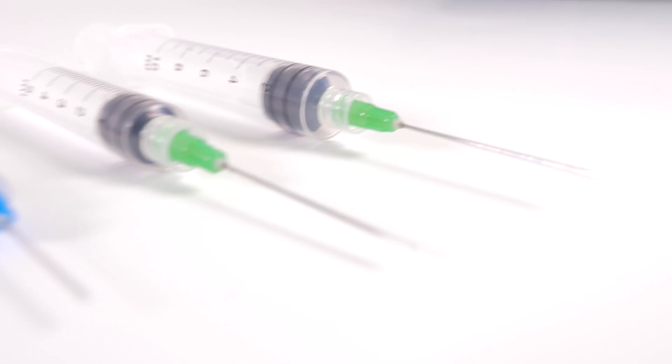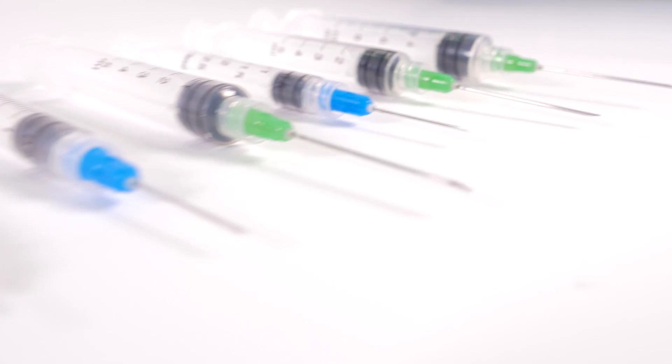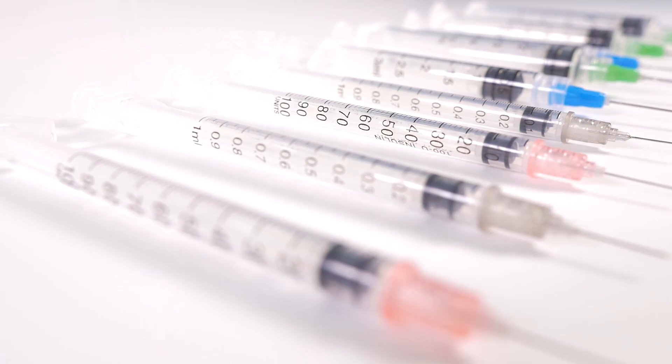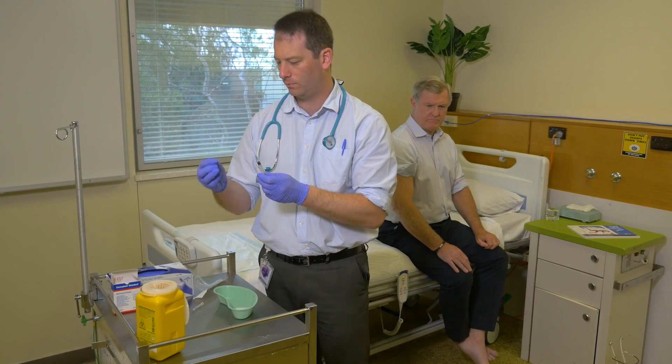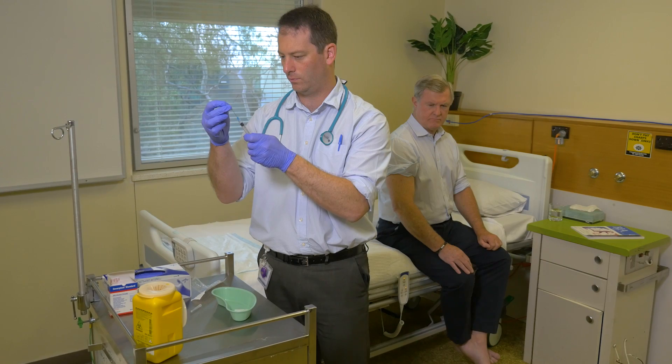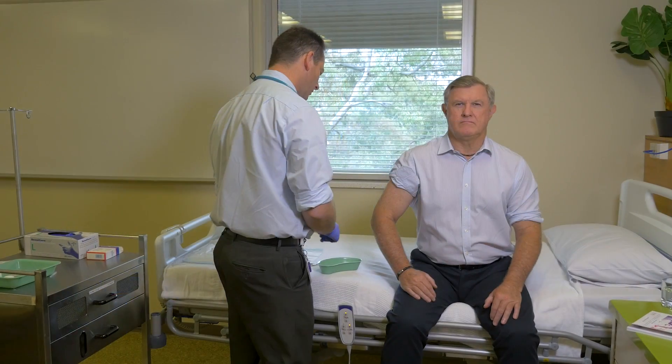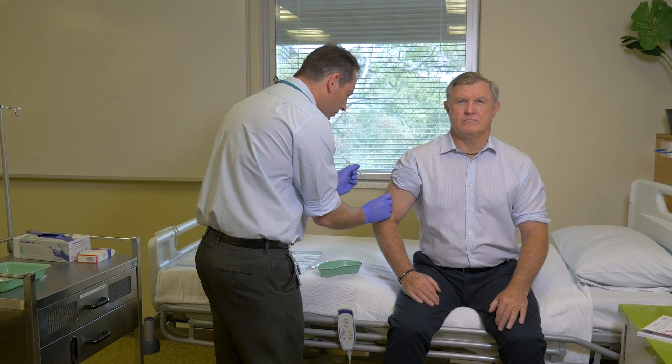ClickZip's globally patented technology eliminates the chance of needle reuse and significantly reduces the risk of needle stick injury, providing valuable protection to health workers, patients and the community as a whole by preventing the spread of disease, infection and blood borne pathogens.